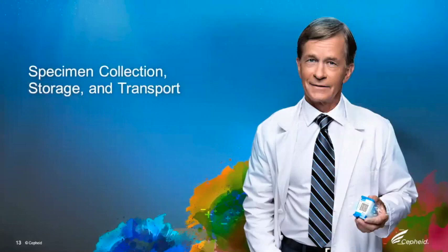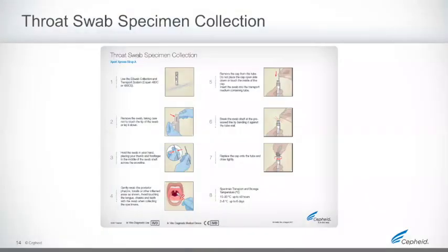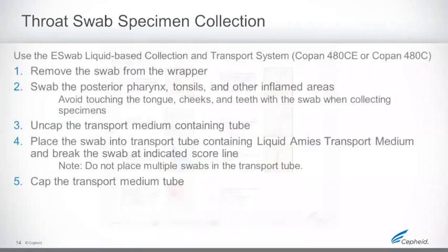Specimen collection, storage, and transport. I refer you to the throat swab specimen collection sheet, which is available through Cepheid. The instructions for the throat swab specimen collection include using the eSwab liquid-based collection and transport system, Copan 480CE or Copan 480C.